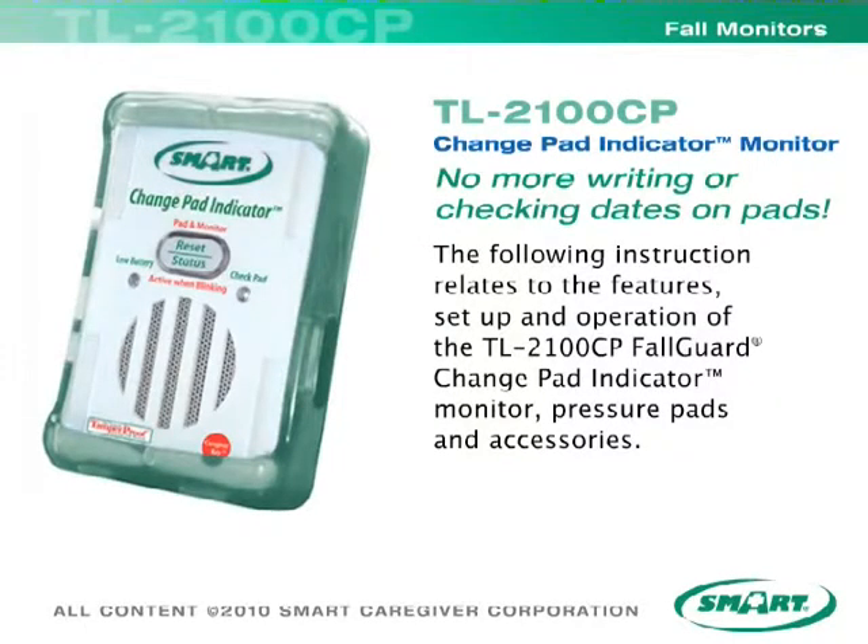The following instruction relates to the features, setup, and operation of the TL2100CP Fall Guard Change Pad Indicator Monitor, Pressure Pads, and Accessories.